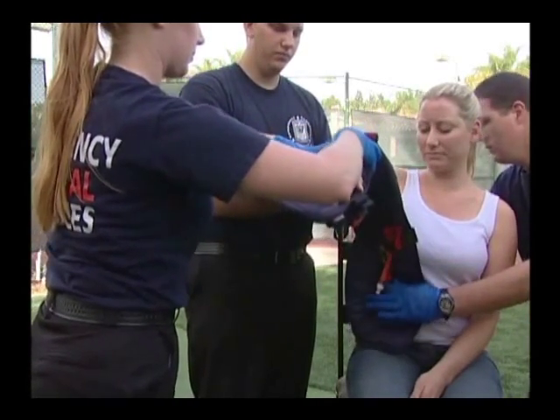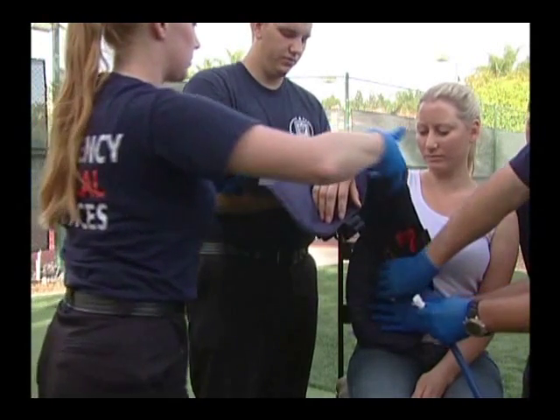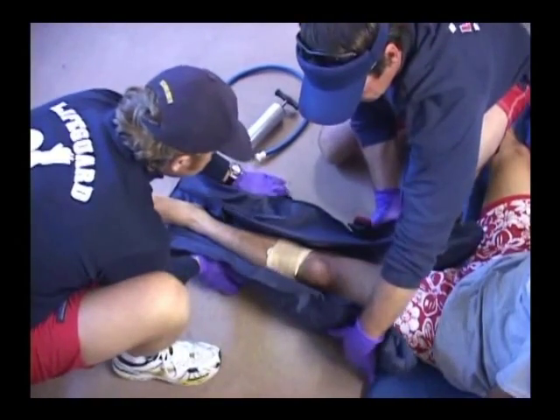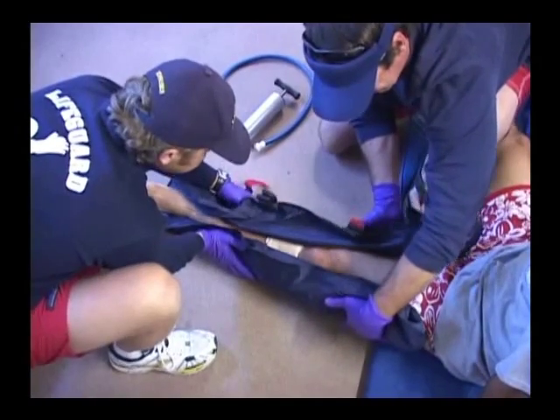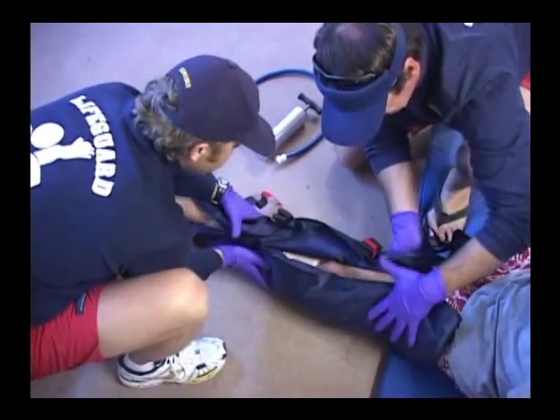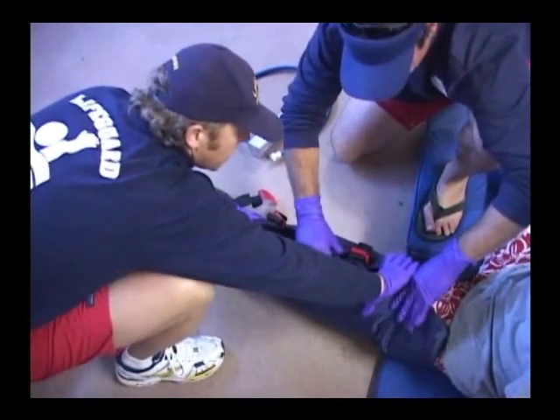Maintain support of the injured area and elevate, if indicated, the injured extremity just enough to apply the splint. Slide or place the splint under the injured area, positioning the splint so that at least one strap is above the suspected fracture site and at least one strap is below the suspected fracture site.